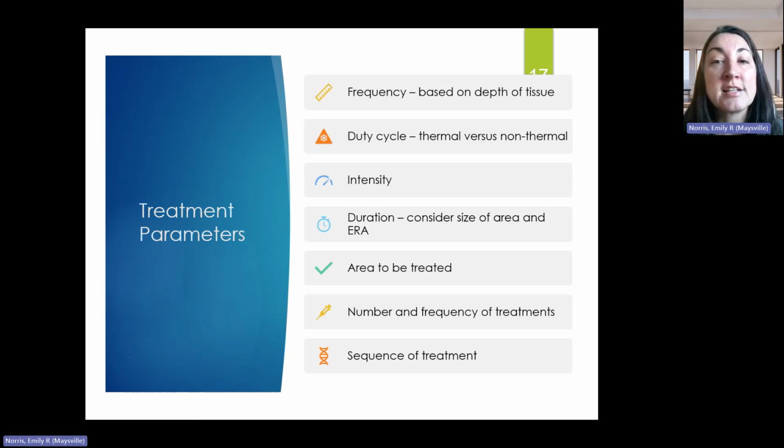And in all honesty, I typically use 8 minutes. A lot of clinicians do that because of the Medicare billing rule of 8 minutes, where you must do a treatment for at least 8 minutes before you can bill for a unit. If you do like 7 minutes, but it takes you a few minutes to set it up and clean it up, then you still spend 8 minutes on that treatment. But being that 8 minutes is right in the middle of that 5 to 10 minute range, that's what I find most people do. I will do longer if it's a bigger area or really thick tissue or something that I want it to penetrate a little bit deeper.